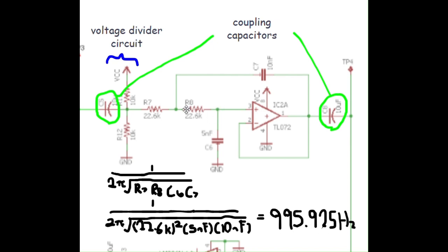Since there are two sets of capacitors and resistors, I can determine that it is a second order low pass filter with a roll-off of negative 40 decibels per decade. Speaking of the cutoff frequency, this is how we calculate it using this formula. As a result, I got 995.925 Hz as my cutoff frequency.